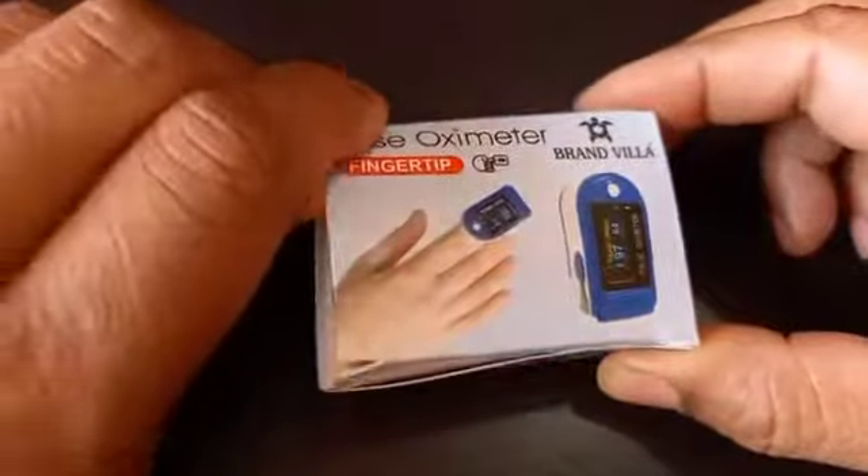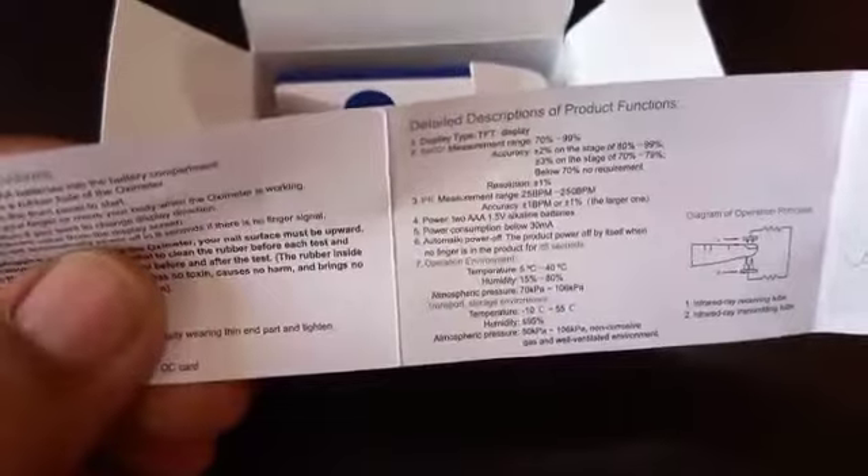First of all, let me open this and see what things are inside. See friends, this is the kind of instruction given by the company — you can say it is a manual about using this equipment.